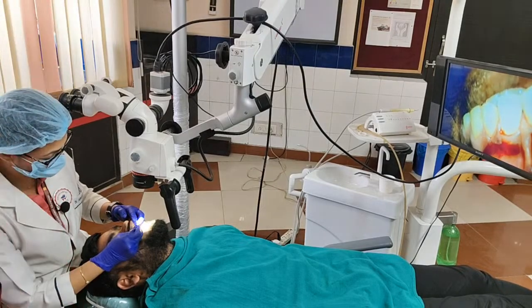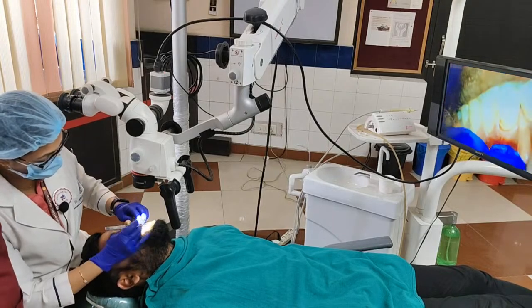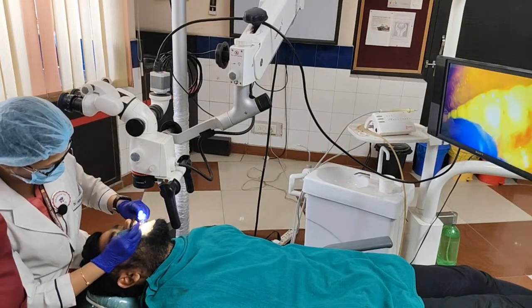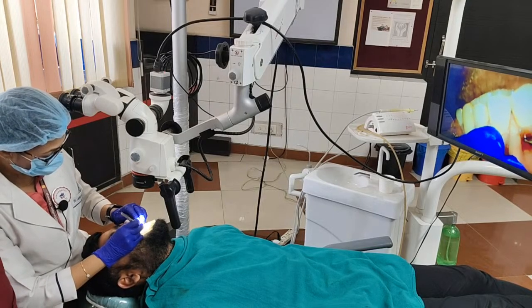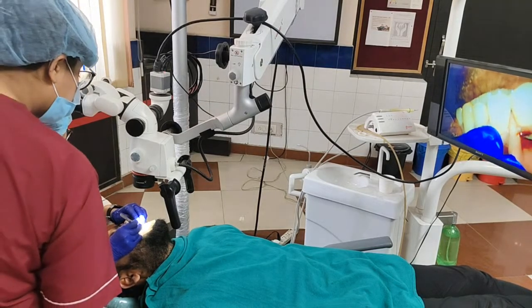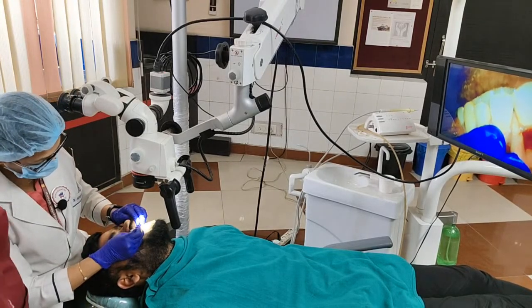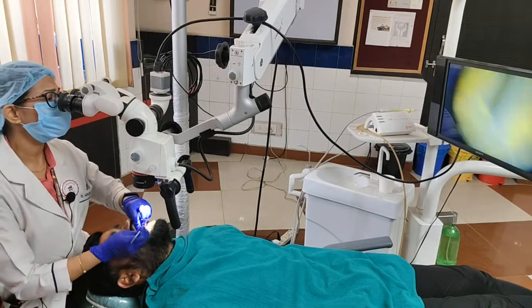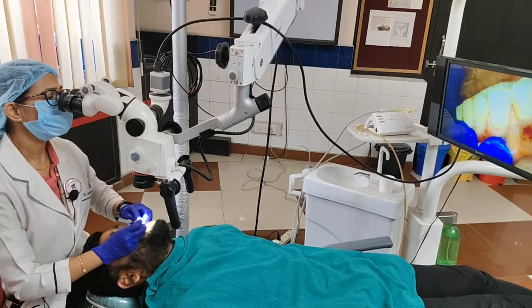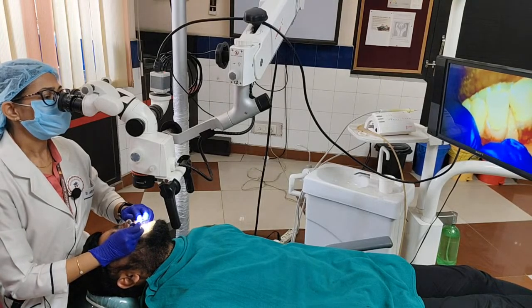In the scraping method, you just keep scraping the epithelium till you feel the pigmentation is gone. Remember not to go too deep. Stop when you start seeing the raw connective tissue surface. A raw bleeding connective tissue surface tells you that the epithelium is gone. Another way to know is that the colored pigments go away, and the shine.